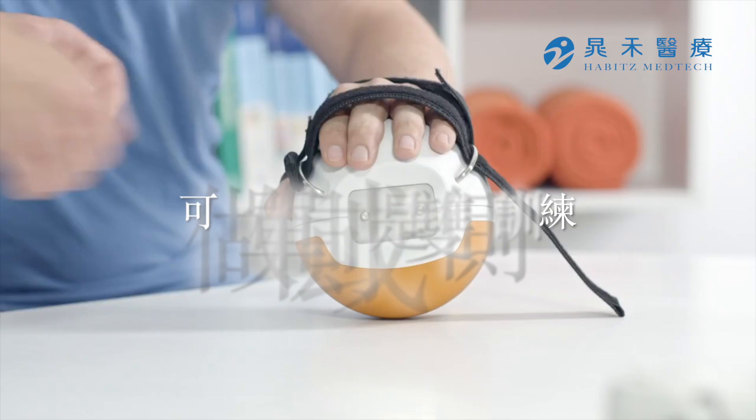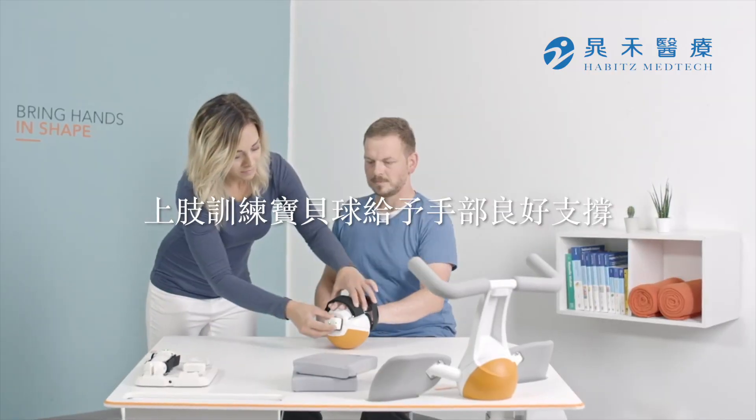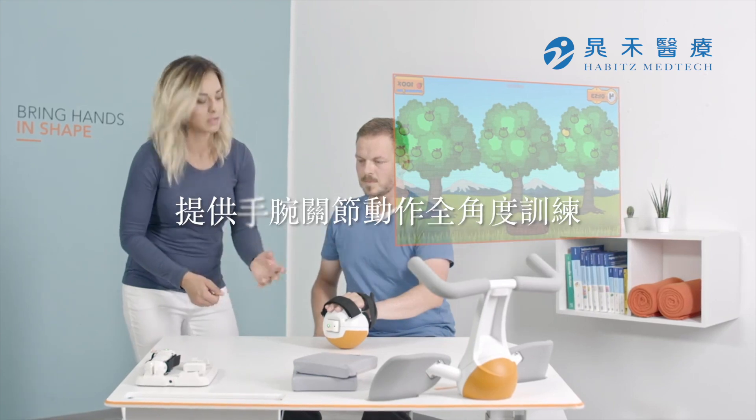The multi-ball's new design supports pronation and supination training, as well as wrist extension and flexion training.